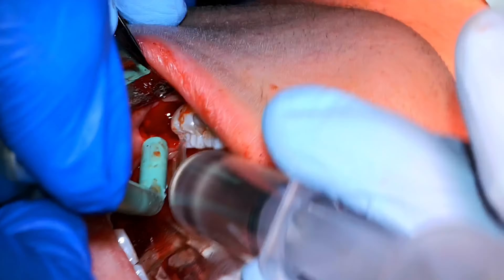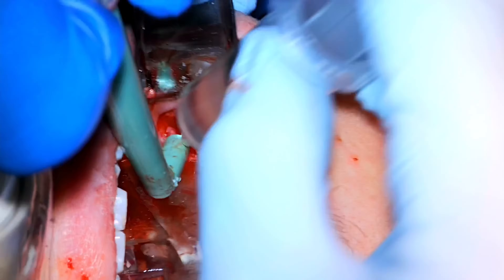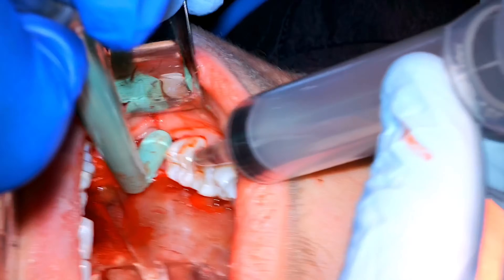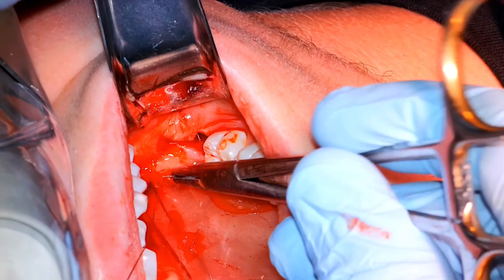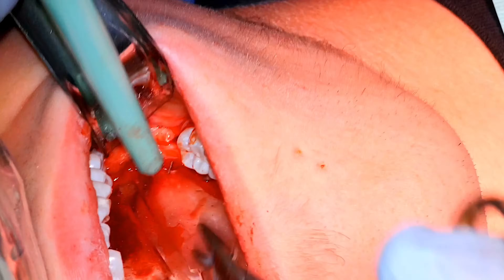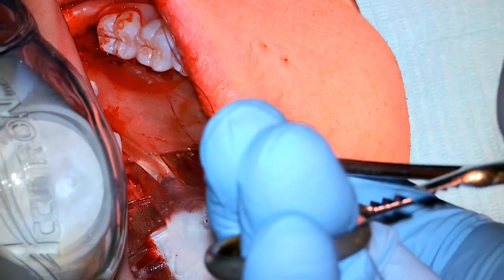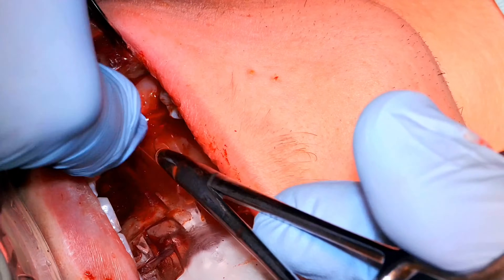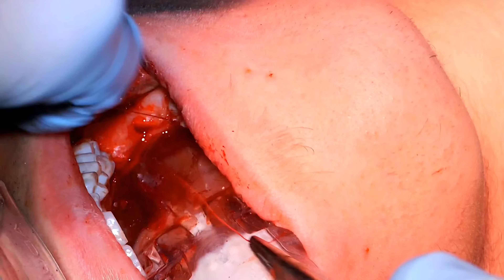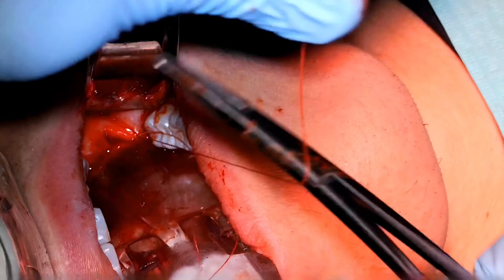We're irrigating under the flap and down in the socket just to get everything tidied up. Then we go back with our 4-0 suture. This is a tapered needle — totally smooth on all sides. The only drawback is that it spins a little in the needle driver since it's round with no flat edges. Other than that, I find it's extremely kind to the tissues, as opposed to a reverse cutting needle. It's quickly become my go-to suture for third molar cases and elsewhere in the mouth as well.